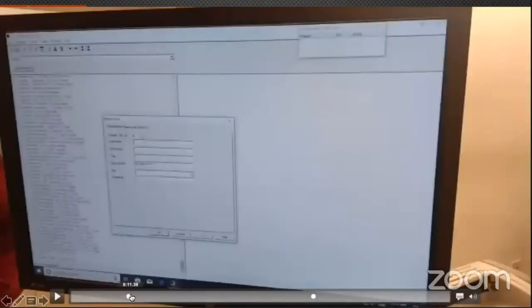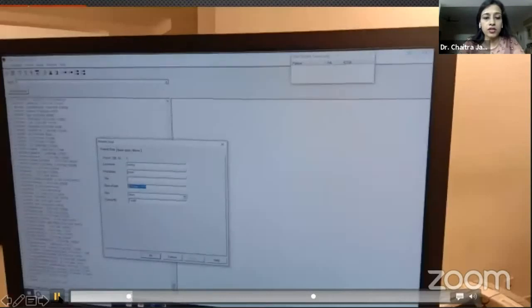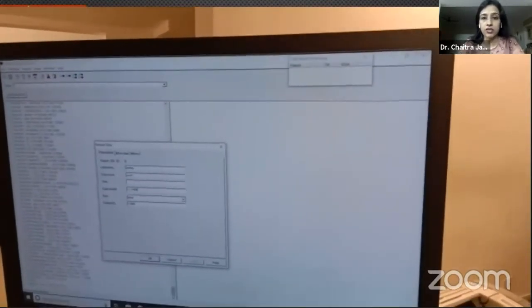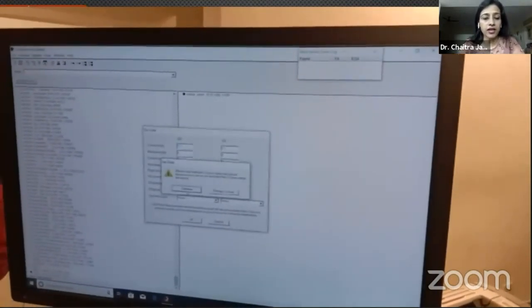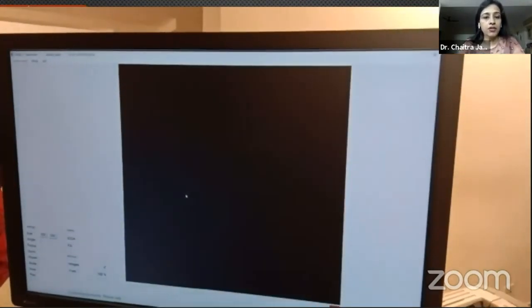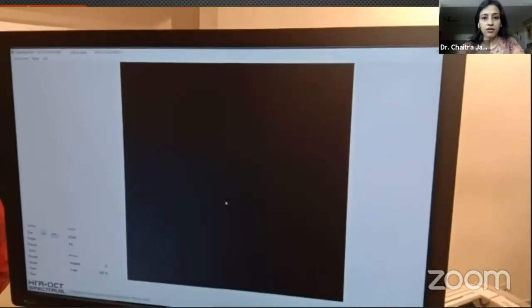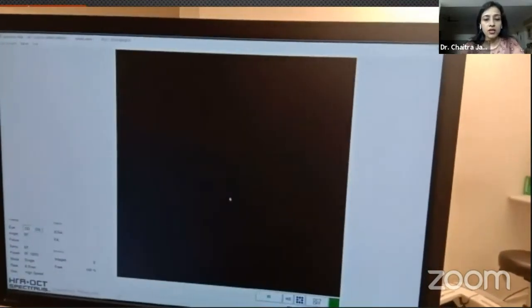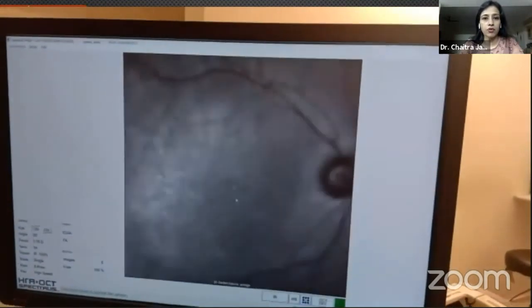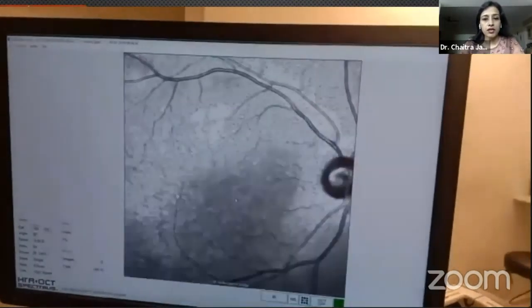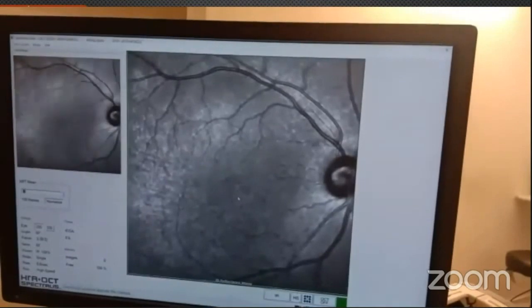This is a short video showing how acquisition is done after including all the patient's parameters and details. The required protocol is selected and scanning is started. The patient is given a target for fixation, and once you get good illumination and scan strength, you go ahead acquiring the images. You can see the patient position and the scanning protocol coming into view, very nicely focused — this is when you start acquiring the image.